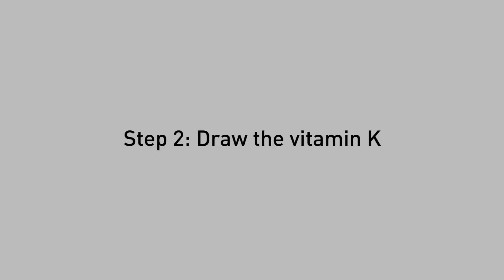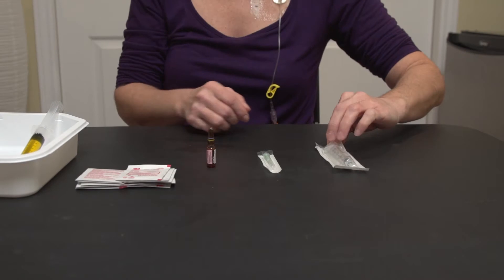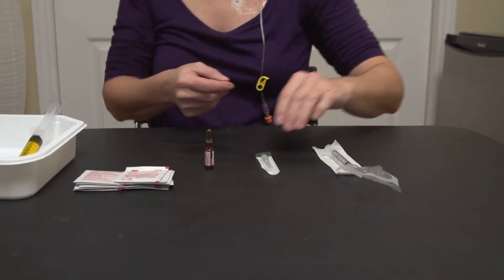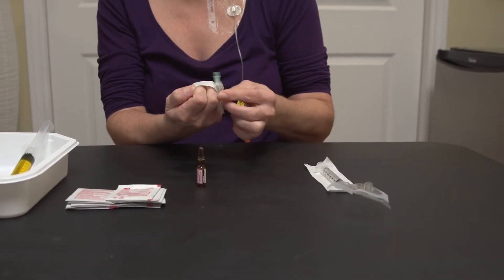Once a week, on the day prescribed by your physician, you must add vitamin K. The amount to be injected depends on your medical prescription. The technique for drawing vitamin K is different because it is contained in an ampoule. Proceed as follows: remove the 3 milliliter syringe from its package.